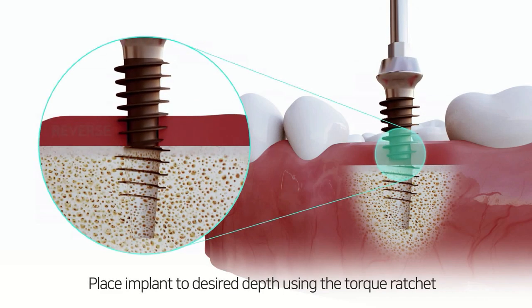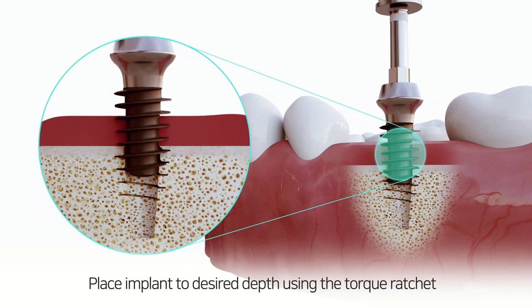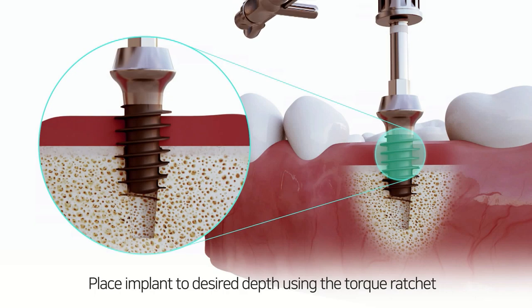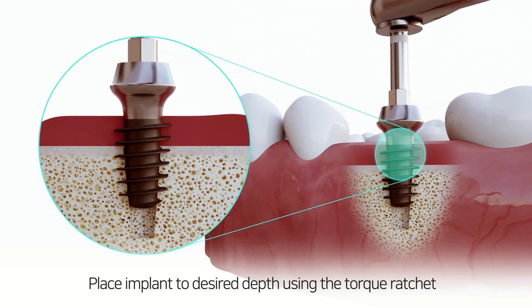Place the implant by hand, noticing that the magic core's fin thread matches and follows through the created tap within the wall of the hole. Place the implant to the desired depth using the torque ratchet.